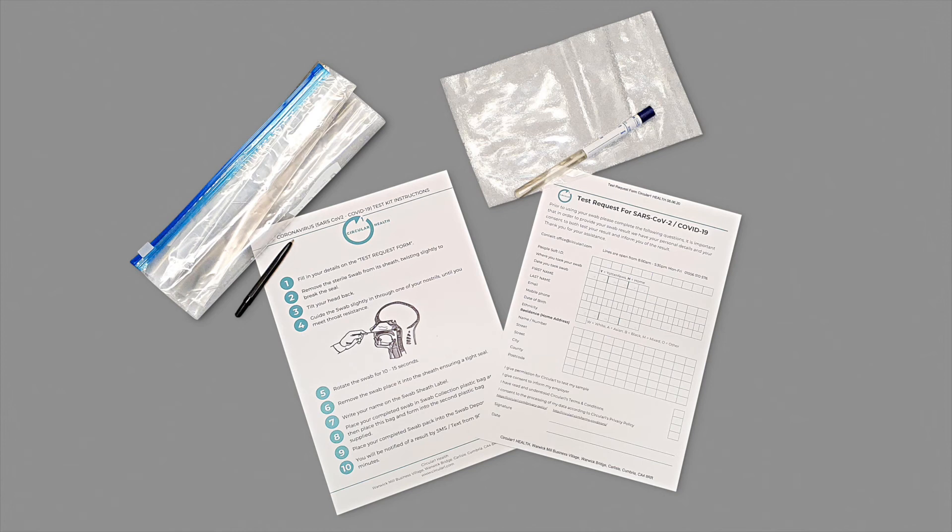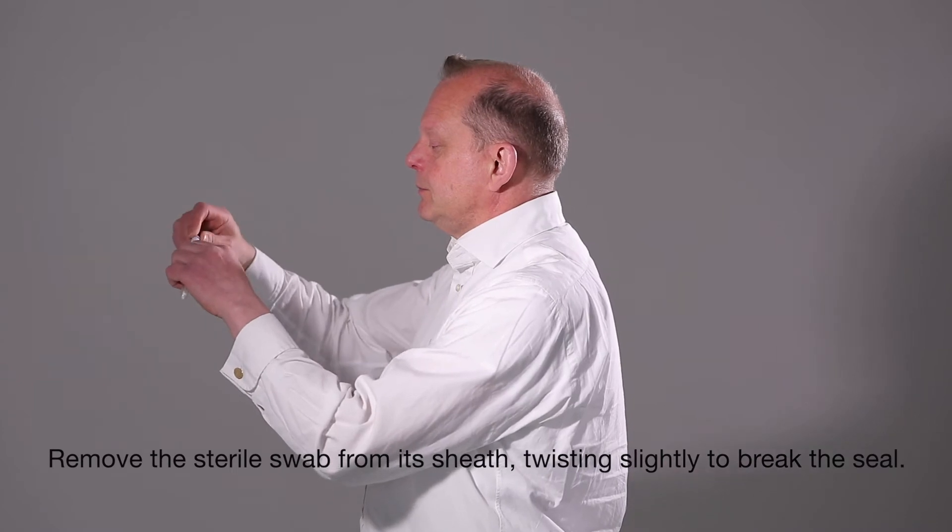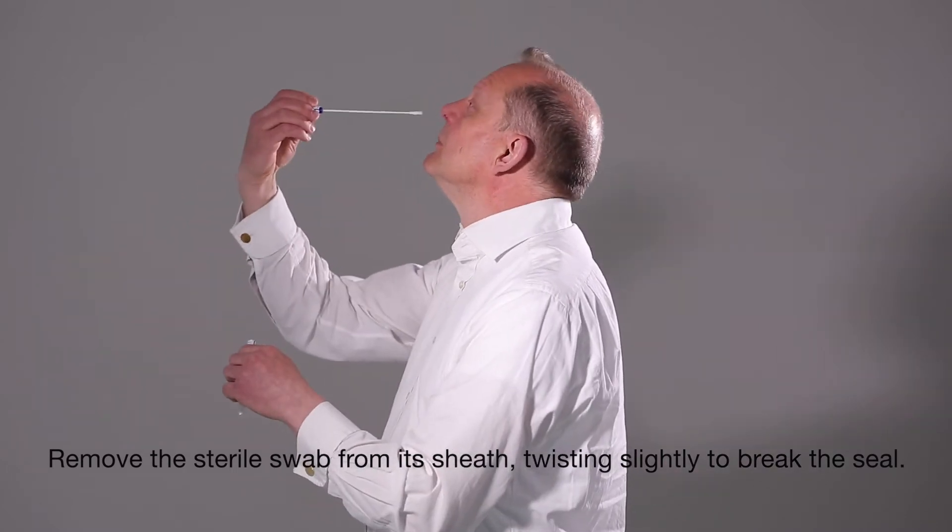Fill in your details on the test request form. Remove the sterile swab from its sheath, twisting slightly to break the seal.